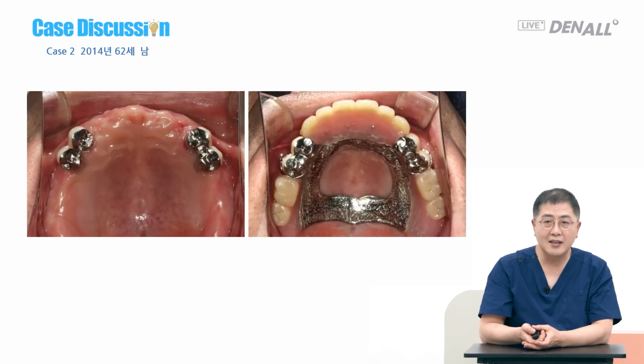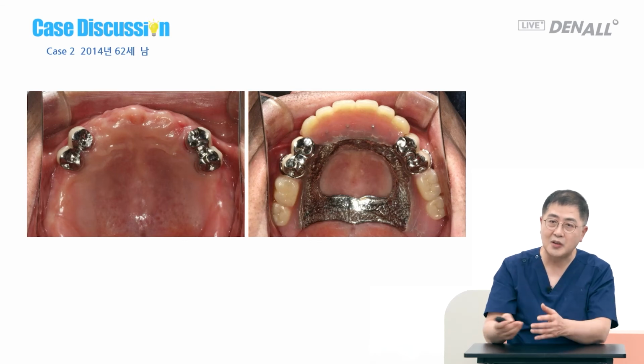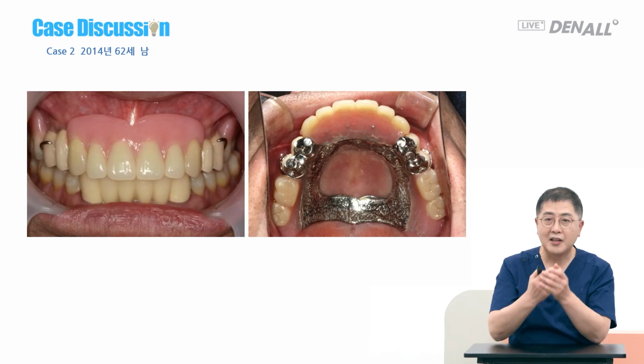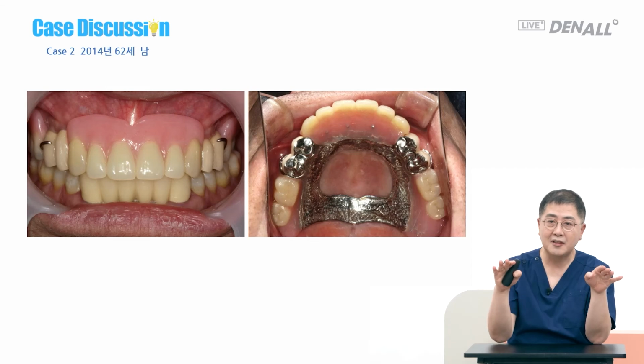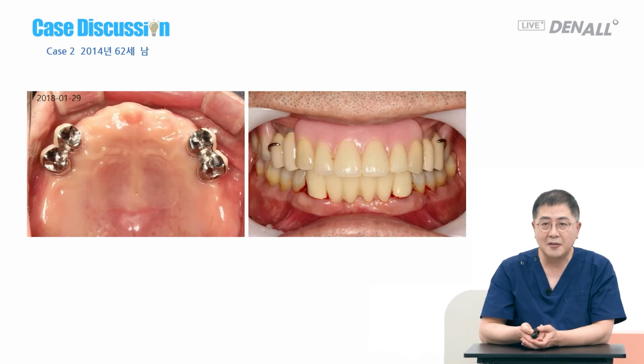Wherever the bone is good, a surveyed crown is made; zirconia or PFM can be used to make the surveyed crown. For the RPD, this is a denture providing good lip support. Here, the anterior clasp is not made, so it is aesthetic, but an anterior clasp can be used for old people.